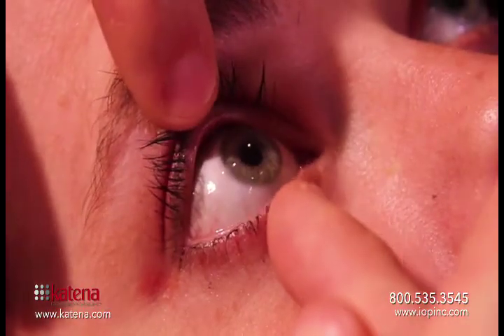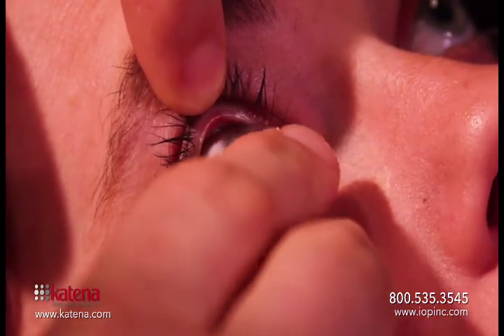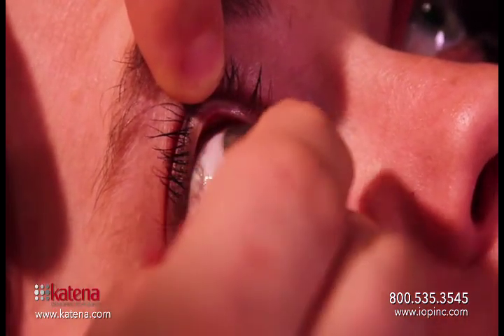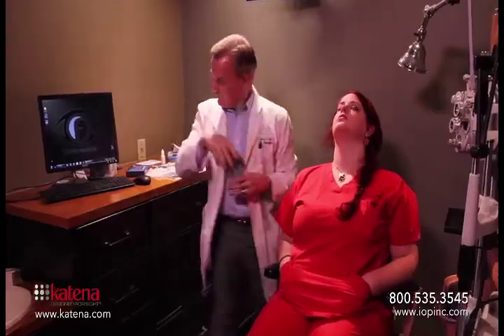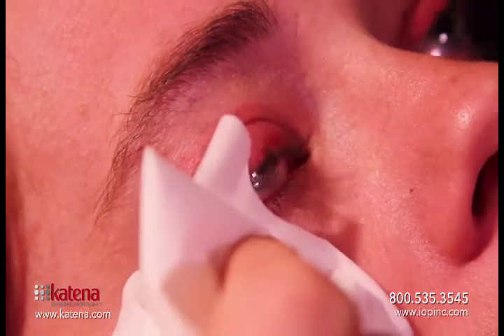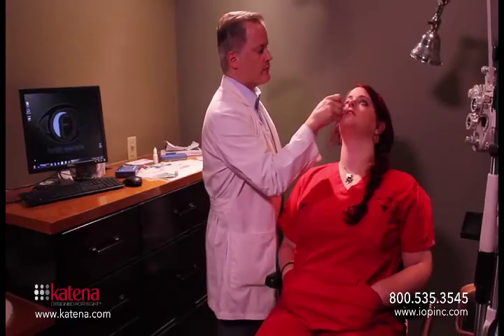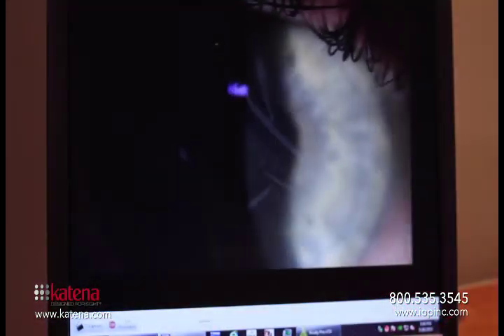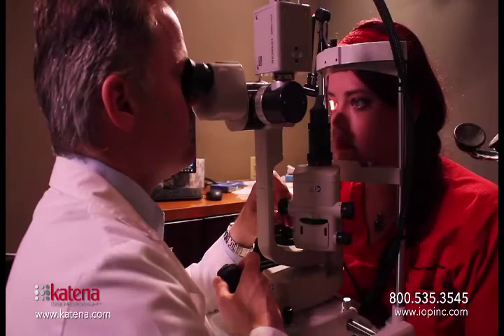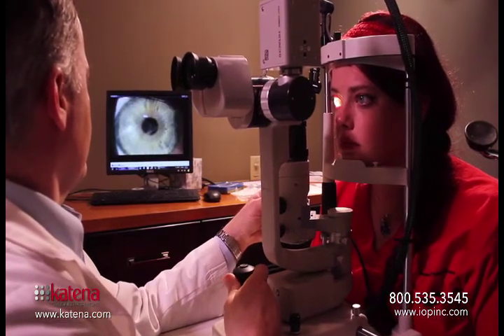At this point it's as simple as inserting a contact lens for a patient. The main thing to remember here is to get the lids out of the way. Get the eye nice and wide so that you can get the lens cleanly on to the surface of the eye. The lens is going to be a little dry and the patient's eye may be a little uncomfortable — that's okay. Go ahead and dry any excess tears away and give the AmbioDisc and lens a chance to adhere to the surface of the eye. You'll want to take a look at the lens with a microscope. You can see some minor folds here — those are not a big issue.